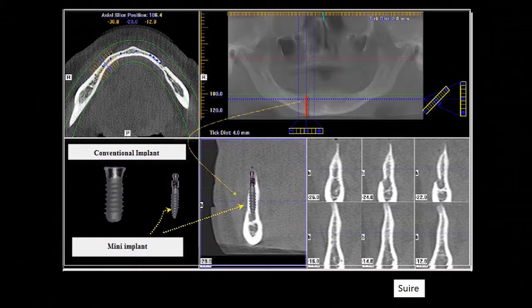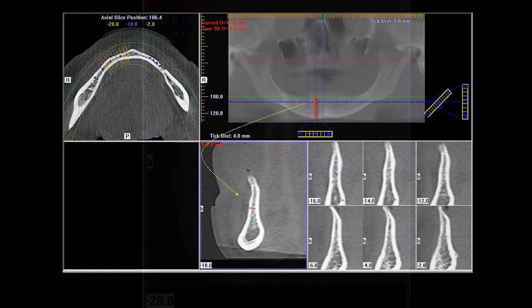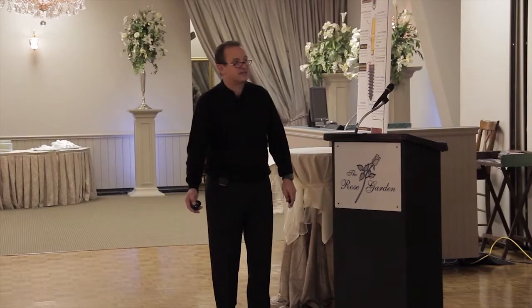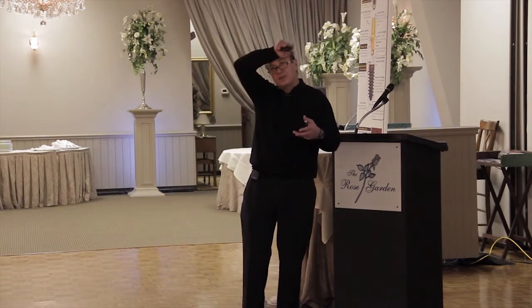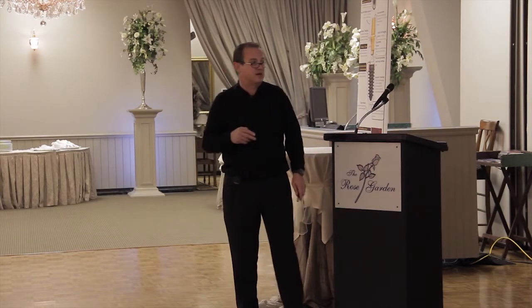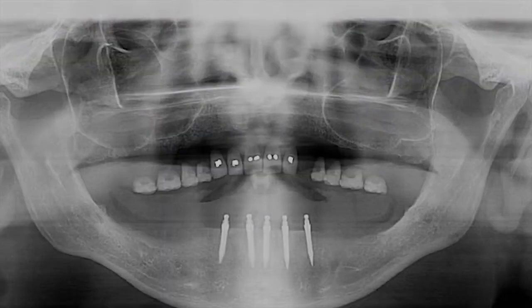This will. And so as far as treatment options go, real cost conscious and all these other things, it's like, well, look, you got these cortices that are almost touching each other. The only thing that we can use are mini implants in a case like this. Like I said, I don't do a lot of them. I did 4 this week. I probably hadn't done a mini implant in 4 or 5 months. It's been a long time, because I believe in the real thing. But for this case right here, which is working out real well, I think that was the treatment of choice.